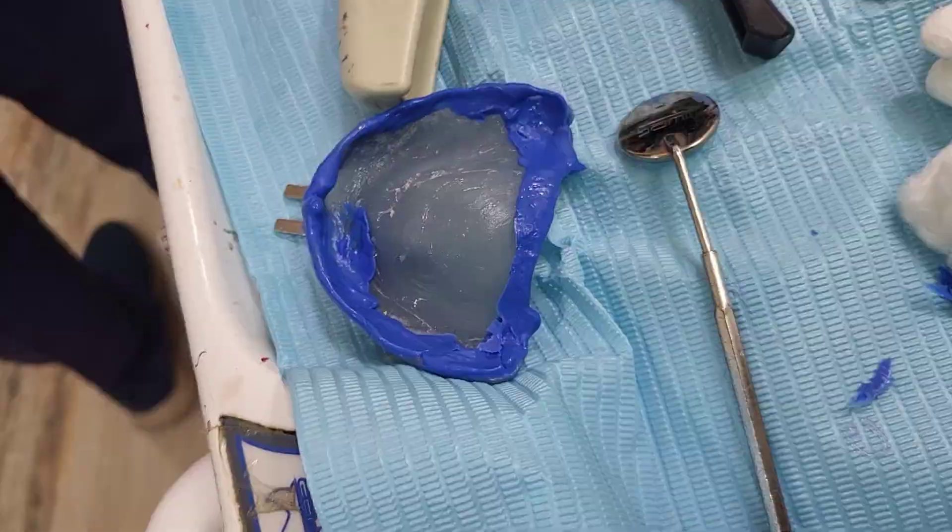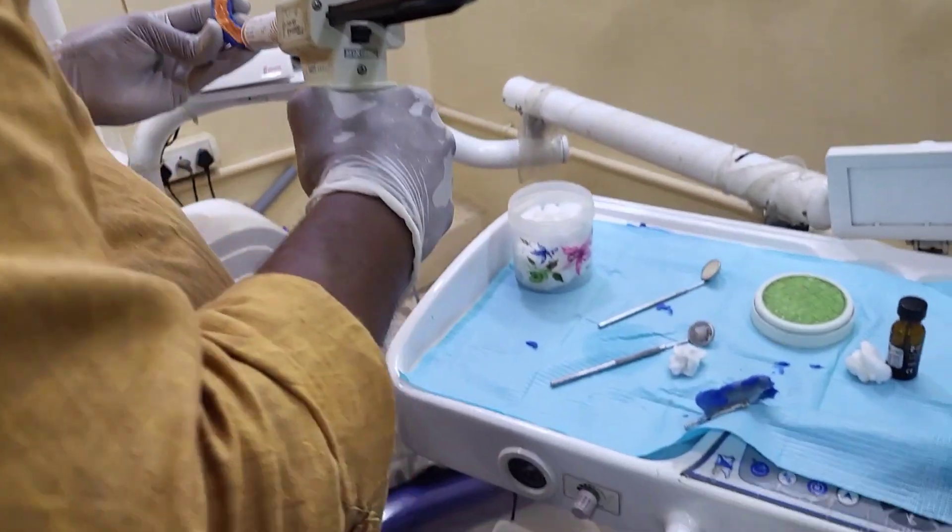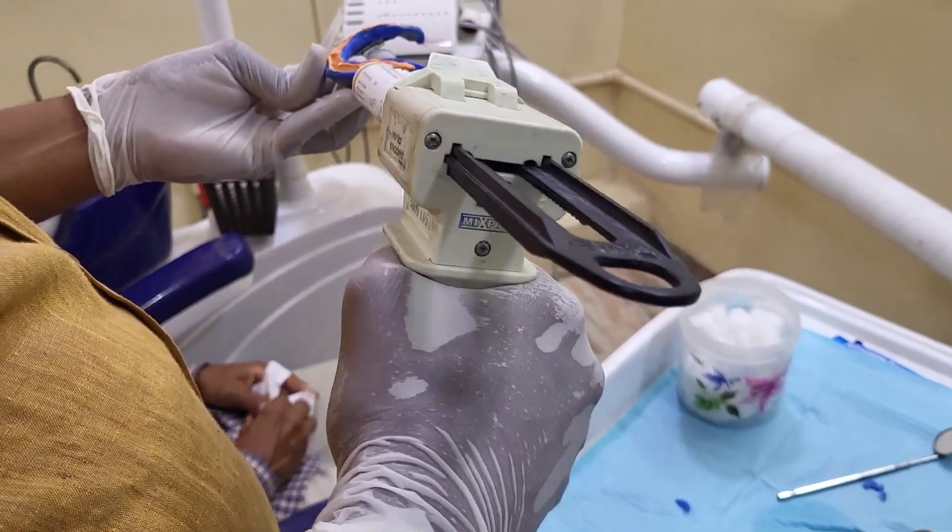Now the border molding procedure has been completed. Later, we are going to take the secondary impression with the help of light body.